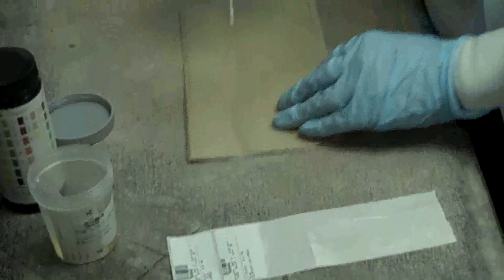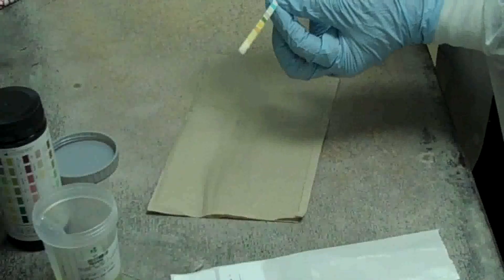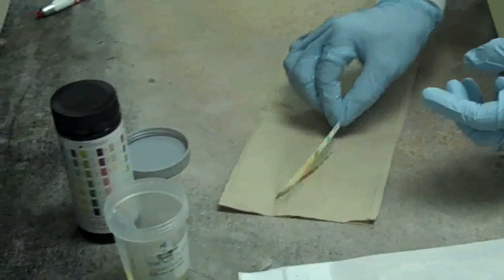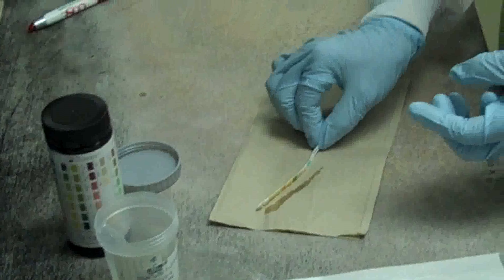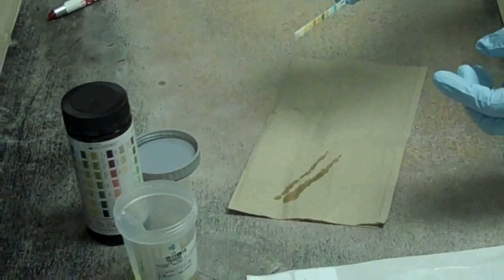Immediately set timer, start timer, and blot the test pad edge of the strip to the paper towel to remove excess urine.